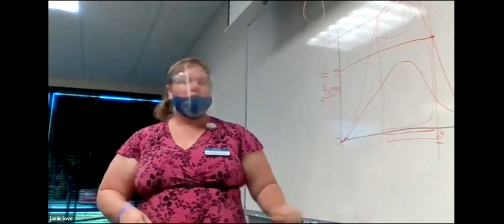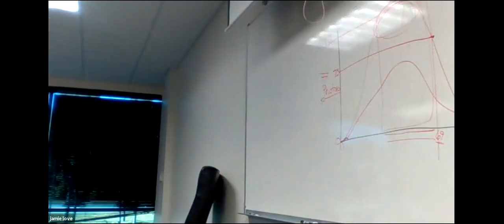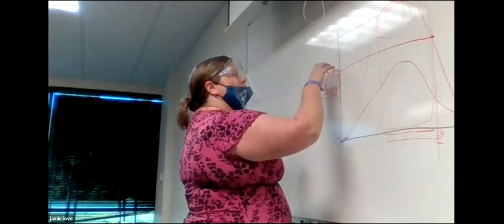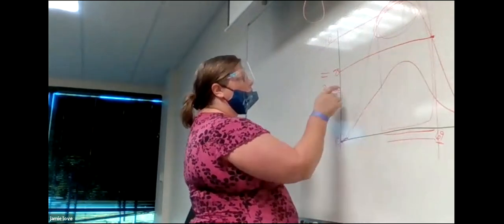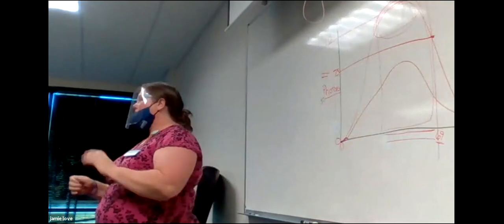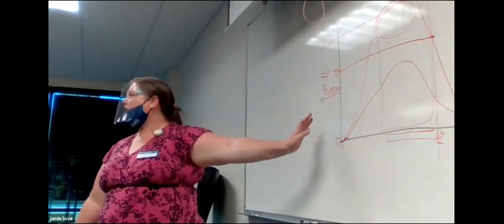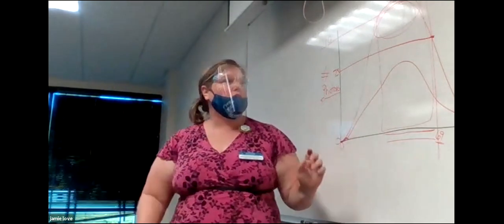At that peak, what's happening at that peak right there? That's just most of our X-rays. So remember, this is the number of X-rays here. So yes, the middle would be the average. So about 25, 50. So these are the X-rays, not the electrons that absorb? Correct. No, these are just the average of the photons, the energy level of our beam. That's what the emission spectrums are all about.